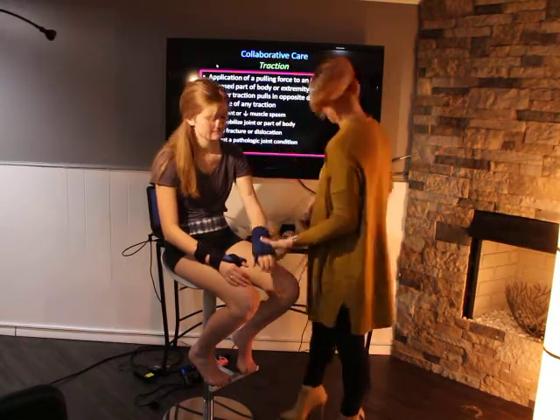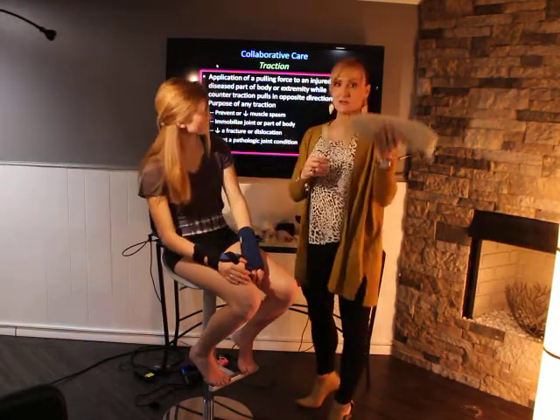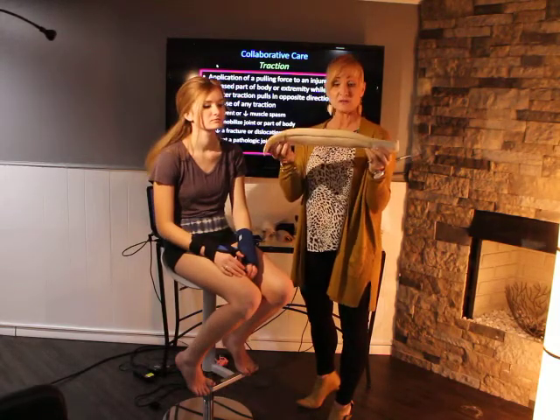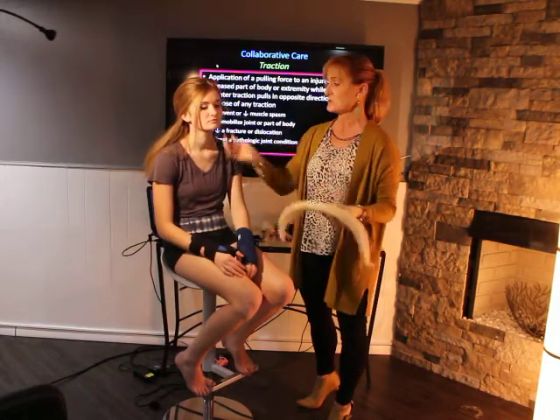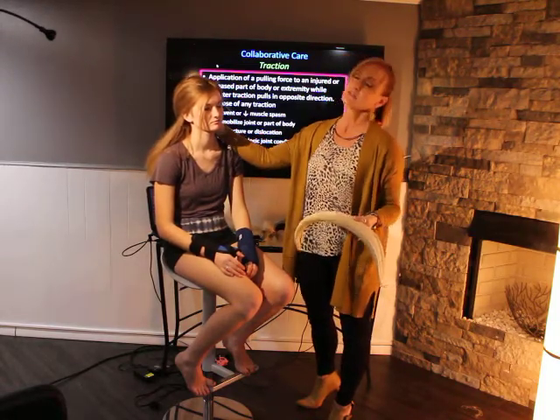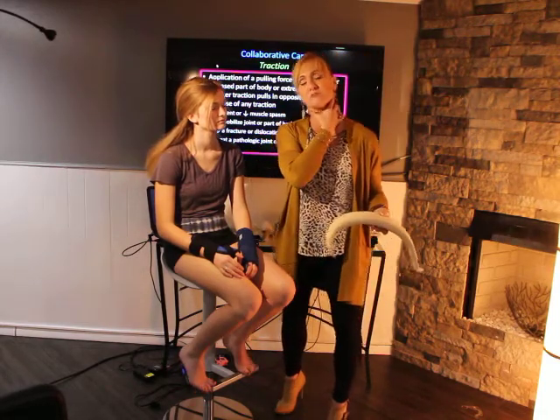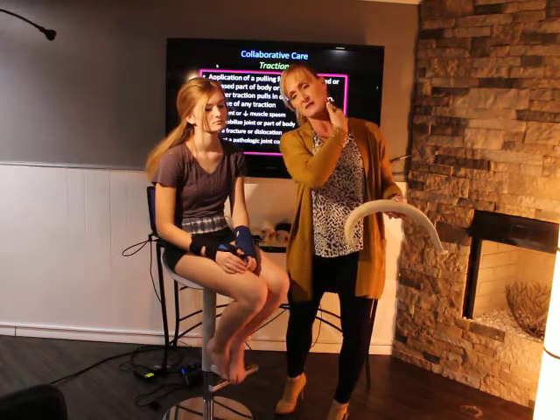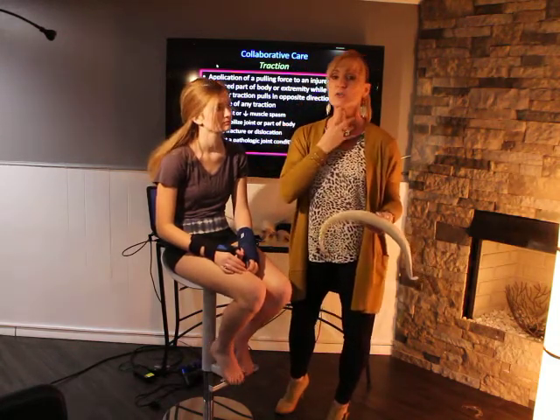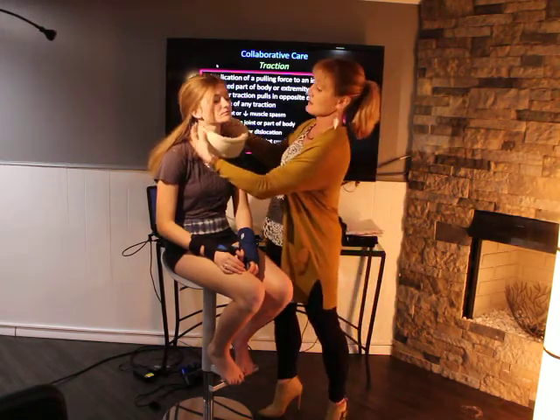So this is another kind of brace. Sometimes they make braces as big as, and as simple as, a neck brace. This is your common neck brace where your patient comes back in. Let's say that they have been in a car accident, they've got what we call whiplash, and a whiplash injury is just a muscle strain. These neck muscles are overstretched beyond their capability, so you're going to want to give some support to that neck so your patient doesn't have to work to keep their neck up.